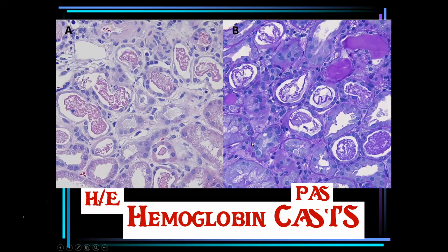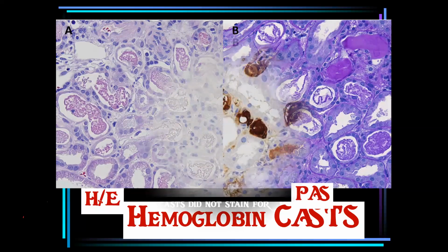The discrimination between these, as we see in the former table, includes the immunohistochemistry and, of course, before this pathology, finding the clinical scenario and the laboratory findings in these patients.